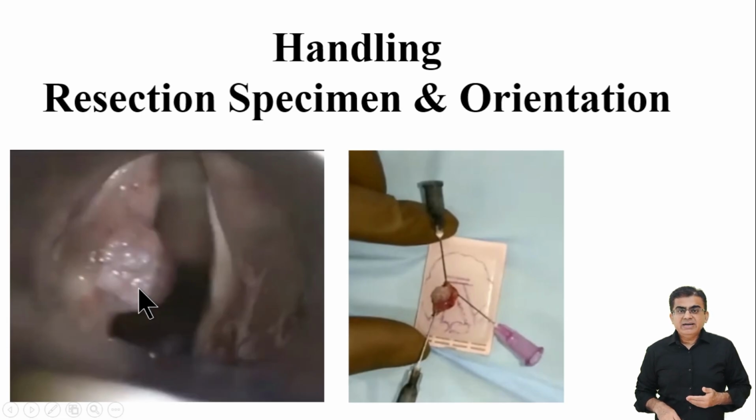Therefore, we must deliberately cut straight through the center of the tumor. We clinically call this a transtumoral or piecemeal resection. But this safe surgical technique creates a major problem for your pathologist. It completely destroys the normal spatial orientation of the tissue. Now look at the image on the right side of your screen. This shows exactly how we solve this orientation problem in the operating room.